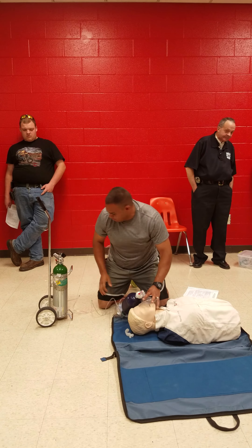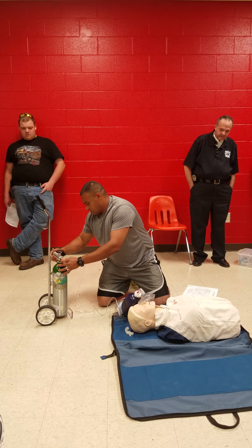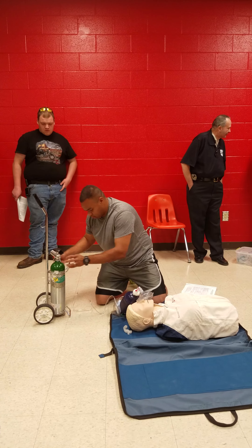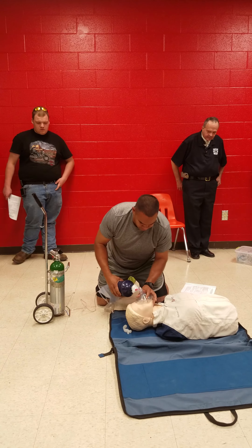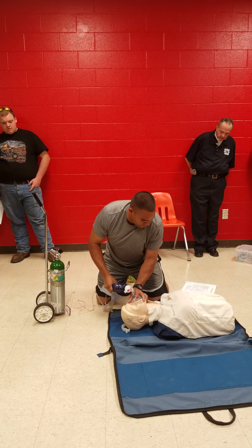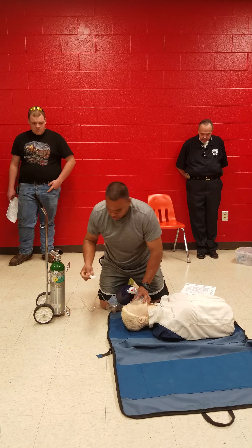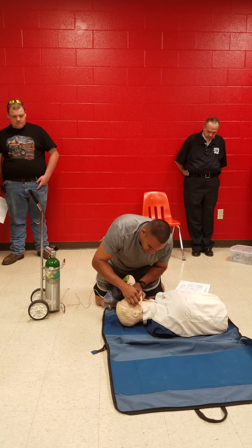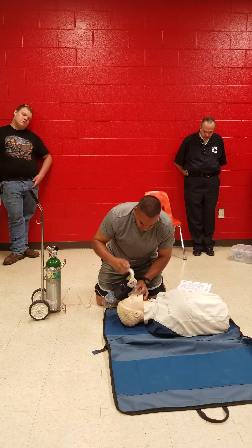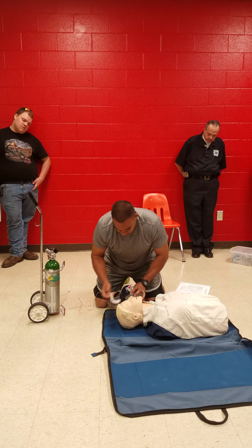Patient continues to keep moving. I'm going to turn my oxygen on to 15 liters. At this point, put the oral pharyngeal airway in. Measure from the ear to the jaw, or to the mouth. Then insert it at a 45-degree angle.